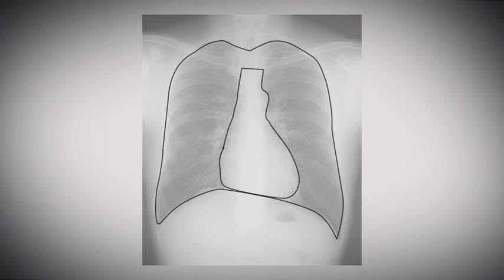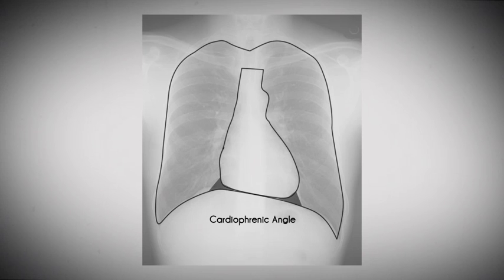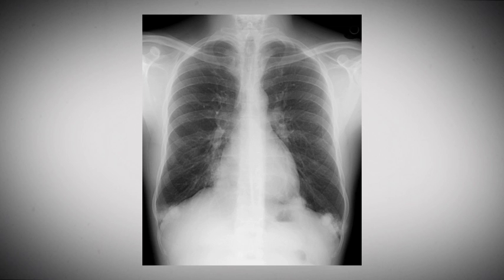Going back to the schematic, note the same structures: the aortic knob, the pulmonary outflow tract, and the normal concavity of the aorticopulmonary notch or window. Also shown are the cardiophrenic angle between the heart and the diaphragm, and both the right and left costophrenic angles between the diaphragm and the ribcage. If there are lesions in these locations, they change the opacity seen in the chest film and may silhouette out the normal diaphragm or heart borders. If the normal concavity of the aorticopulmonary window is obliterated, further investigation — usually a CT scan — is warranted.